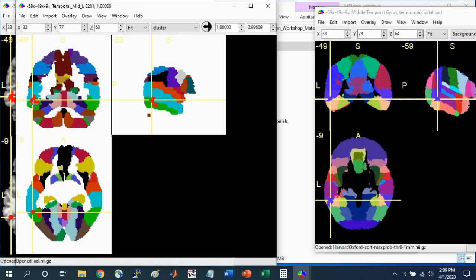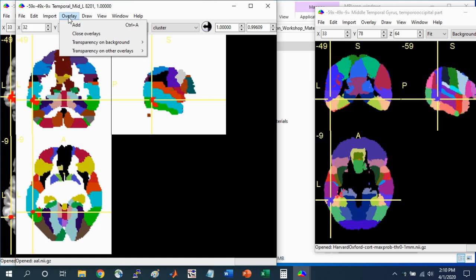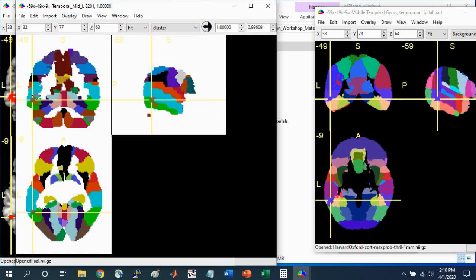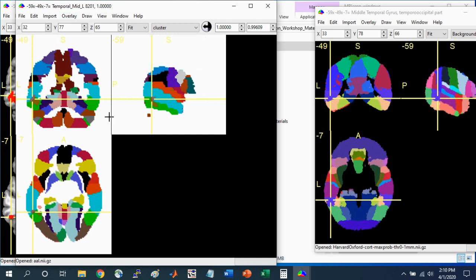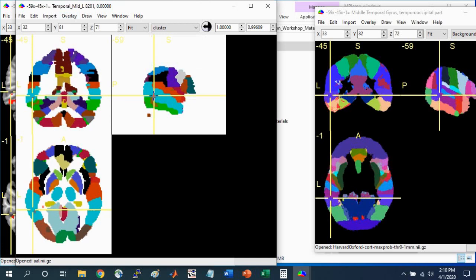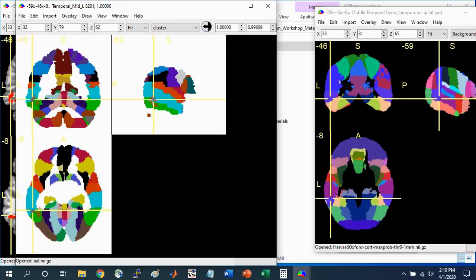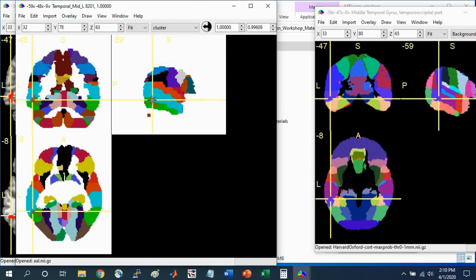If you have any issues viewing the cluster, go to Overlay, Transparency on Background, and make sure it's set to 0% Opaque. If you want to see the underlying image as well, you can change this parameter to make it a little bit more transparent, say 50%. Now you can see the underlying image, in this case the Atlas, a little bit more clearly.